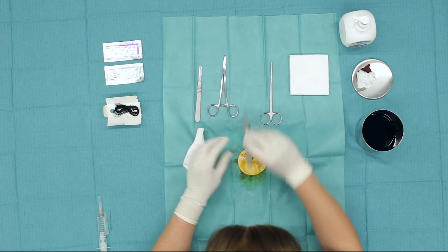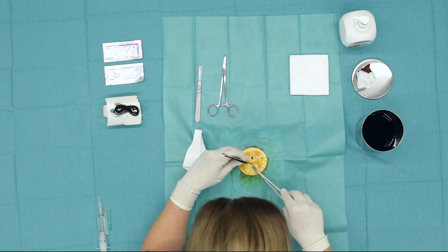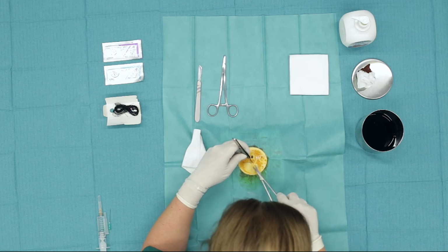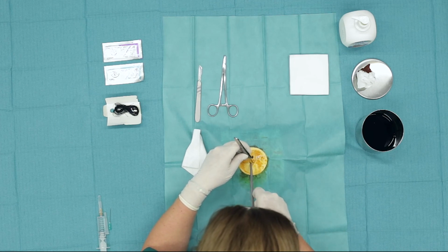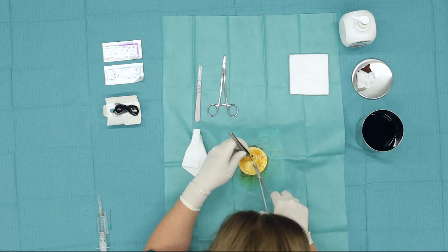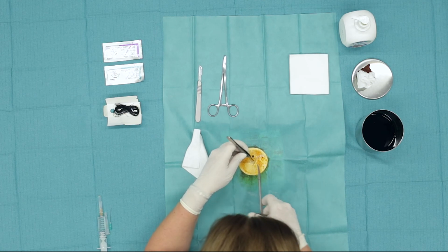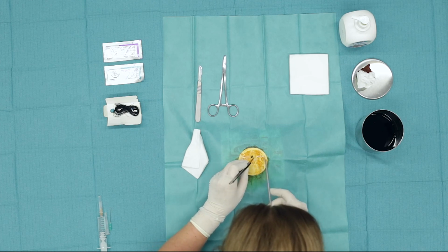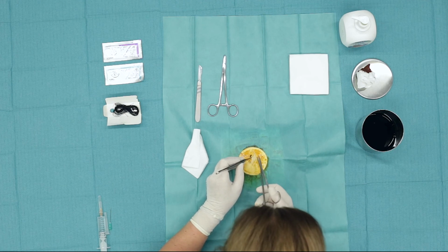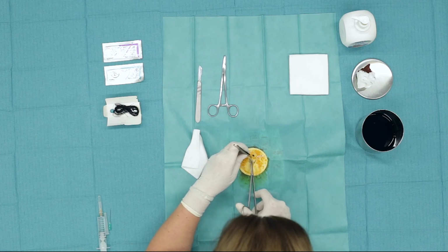Then I can proceed with the surgical forceps and scissors, effectively detaching the formation I want to remove. The surface around the formation to be removed depends on the type of formation, its size and its macroscopic characteristics. If the characteristics of the formation are malignant, the removal of the tissue must be done to a greater extent, in order to ensure the exclusion of the formation in a healthy tissue.